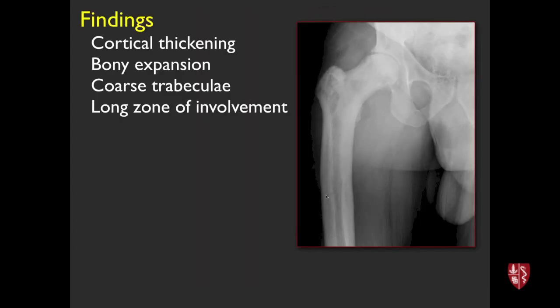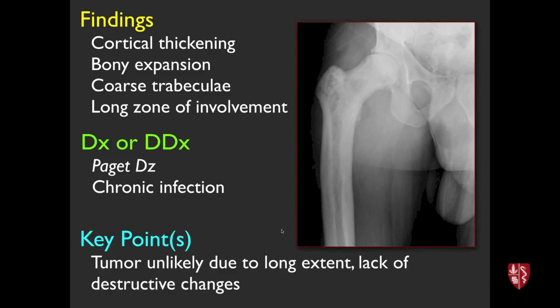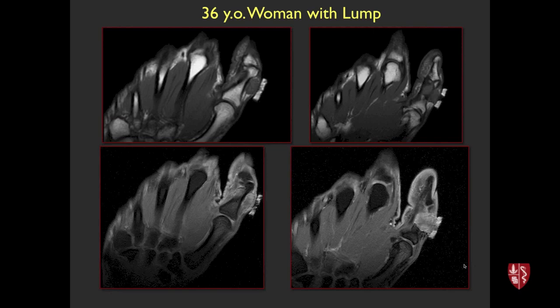65-year-old man, right hip pain. We're seeing a lot of cortical thickening along the femur — very thick cortex, overall expansion, coarse trabeculae, and a long zone of involvement involving almost all the bone shown. There aren't too many things that will do that — this is Paget disease. A chronic infection could potentially look similar. A tumor is unlikely given the extremely long extent of involvement. There's also no destructive change that would suggest a definitely aggressive lesion.